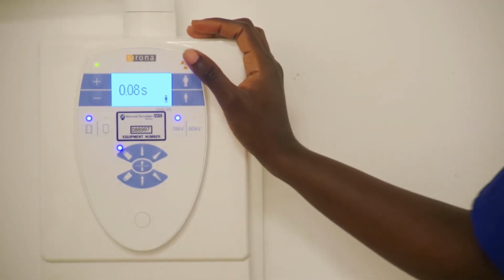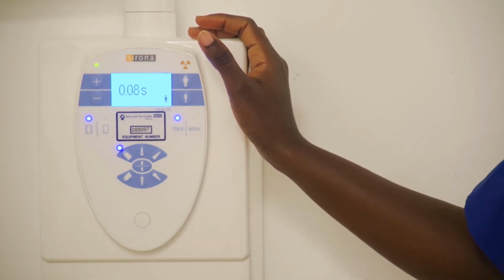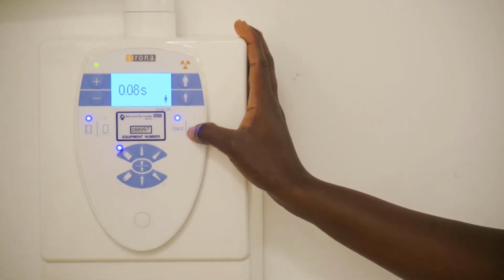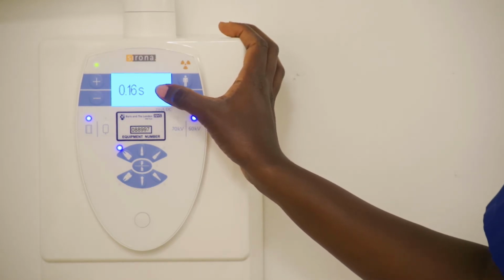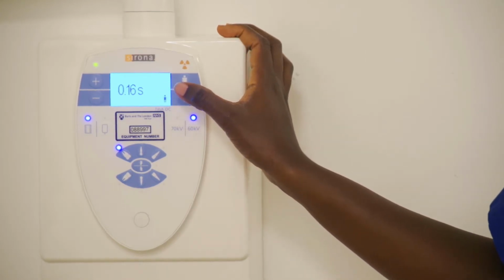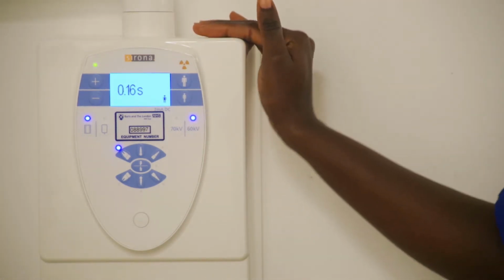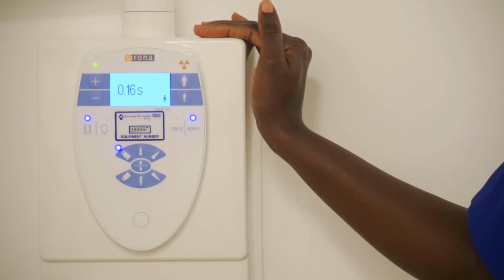Now let's see the effect of using 60 kV, and then you'll understand why we advise you to use 70 kV. If you have it on 60 kV, can you see that the time has increased? It has effectively doubled. What this means is that at 60 kV, this X-ray equipment is producing photons at both high and low energy.